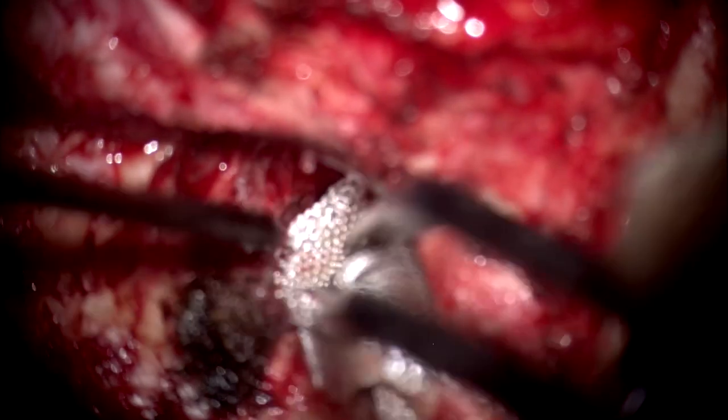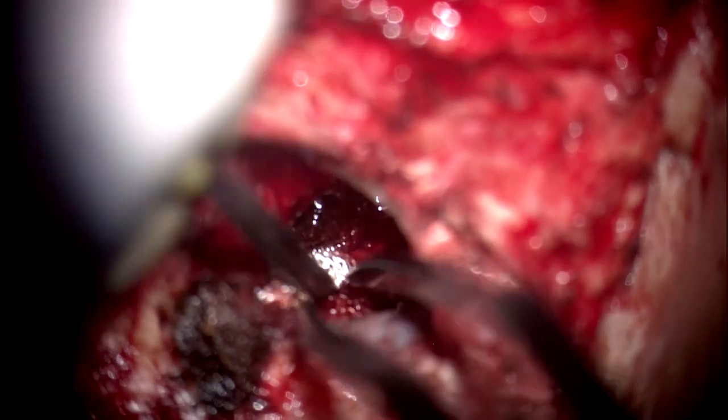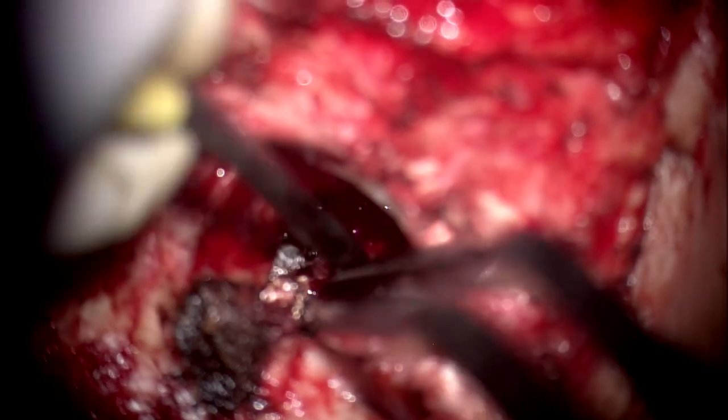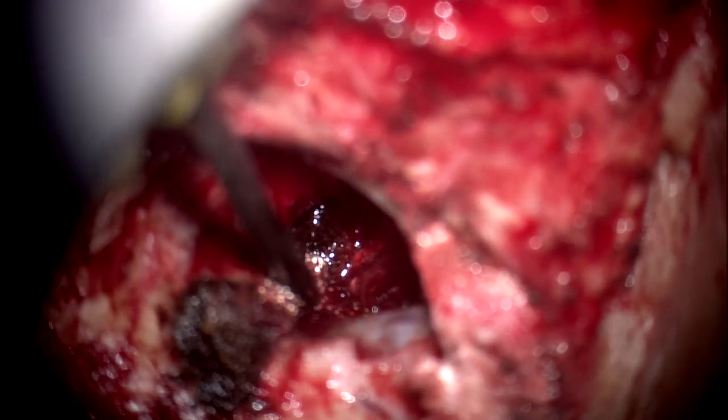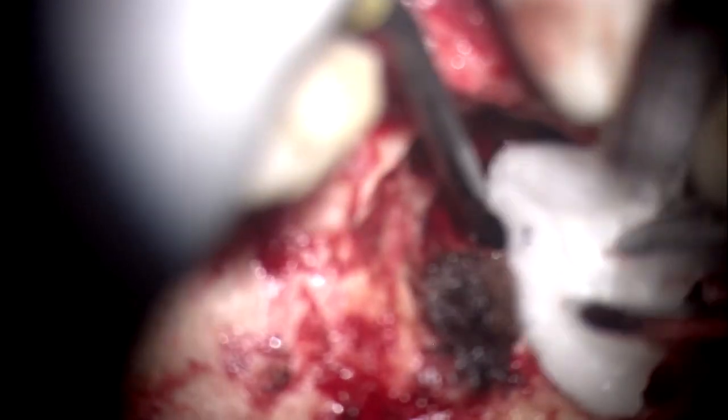We have been able to remove all the patties. Yes, sir. For this surgical, you can leave any amount. Yes, sir. Patty. So things are controlled now. Yes, looking better. Yeah, only one patty is inside.